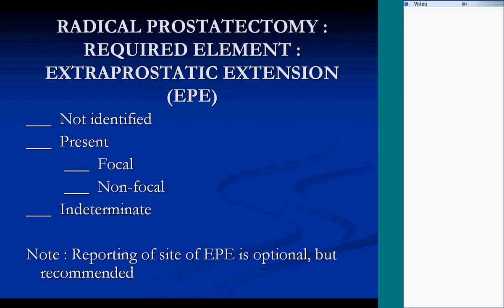Another required element is obviously extraprostatic extension, EPE. And so not identified versus present, and if present, one should specify whether it's focal or non-focal. And even though in the CAP protocol we note that the reporting of site is optional, it is strongly recommended.